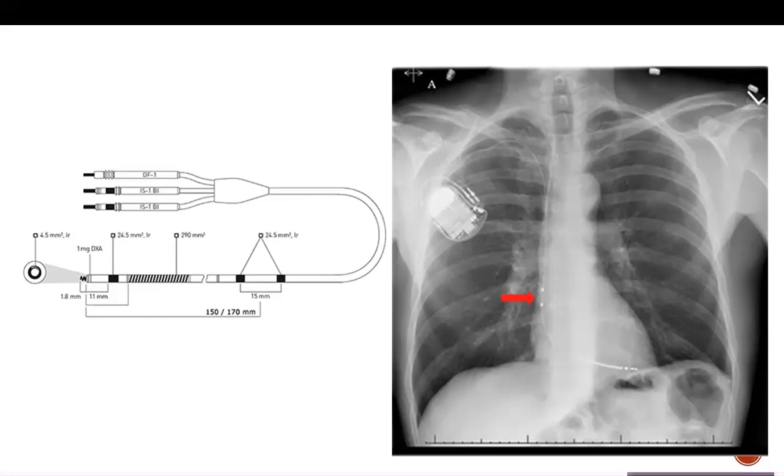Okay, interesting. So there are some kind of modes related to that. When we talked about the common modes, the less common mode is you could only sense the atria. So you're pacing the ventricle in here, but you're sensing the ventricle and atrium. Okay. So the first letter is going to be V. The second letter, VDD. Exactly. So this is how usually this lead works. You could only program it as VDD because it doesn't have any pacing capability to the atrium.